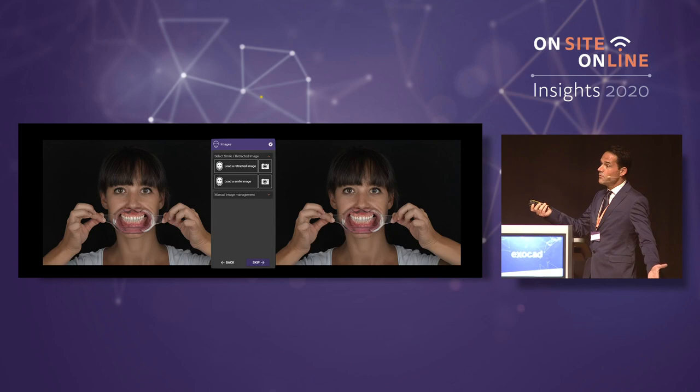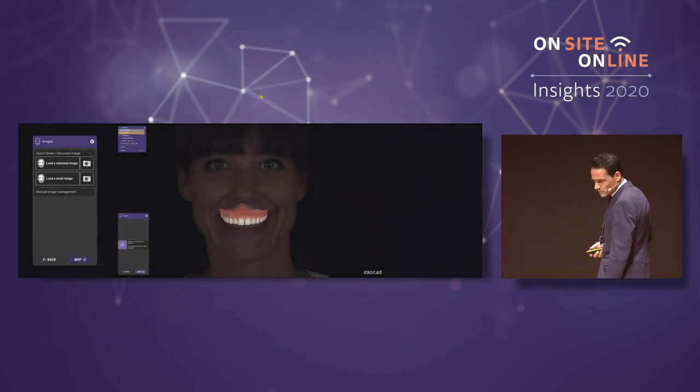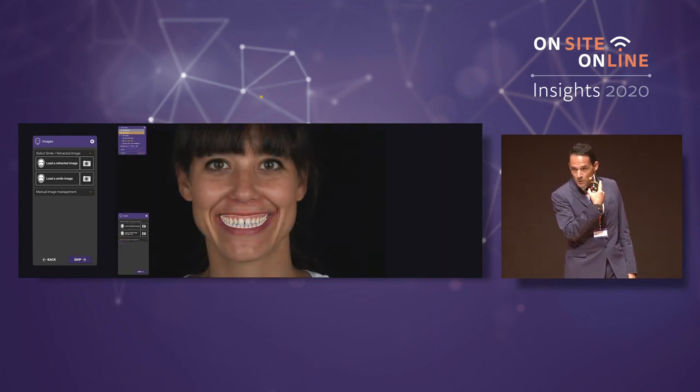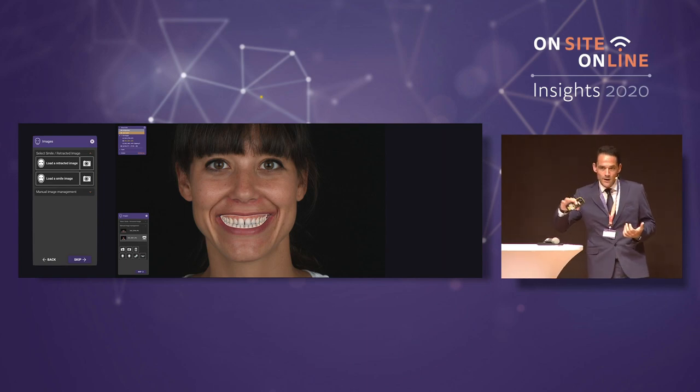As you can see, the movements of the patient between the two images with the mouth retractor, and the matching with the model, is perfect. So go on. Let's continue. Remember, cut out the mouth, this is automatic. For sure, you can move these points and correct if something is not correct. Draw the lip line. This lip line will help us to decide the correct exposition of the incisal areas.